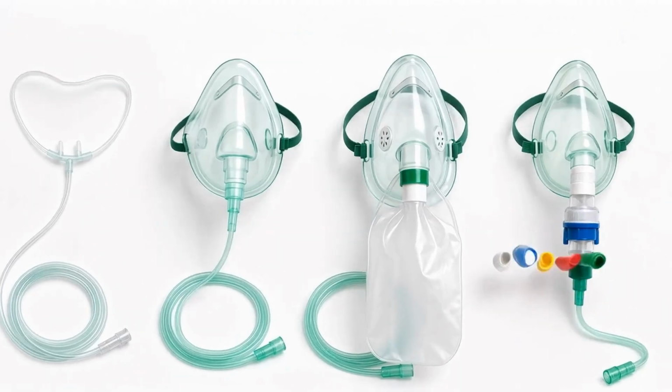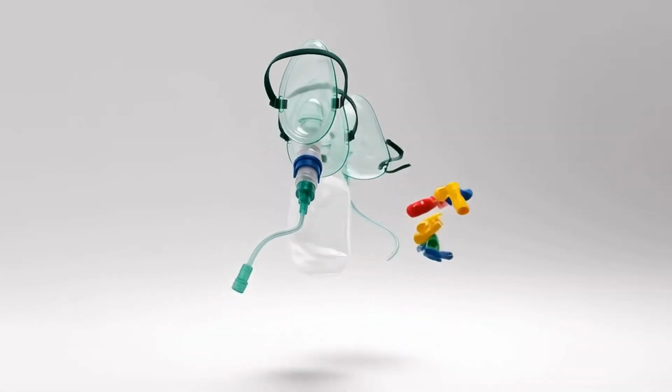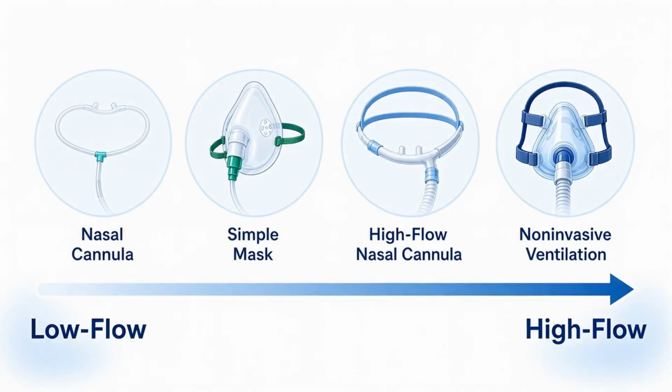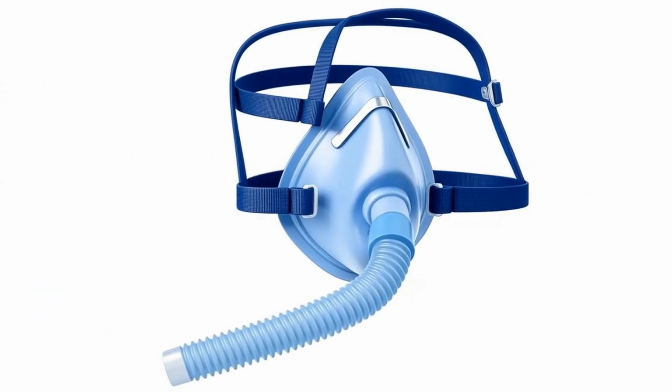We will explore the nasal cannula, the simple face mask, the non-rebreather mask, and the precise Venturi mask in detail. The key is understanding the balance between low-flow support, emergency high-concentration needs, and the requirement for precise oxygen control.